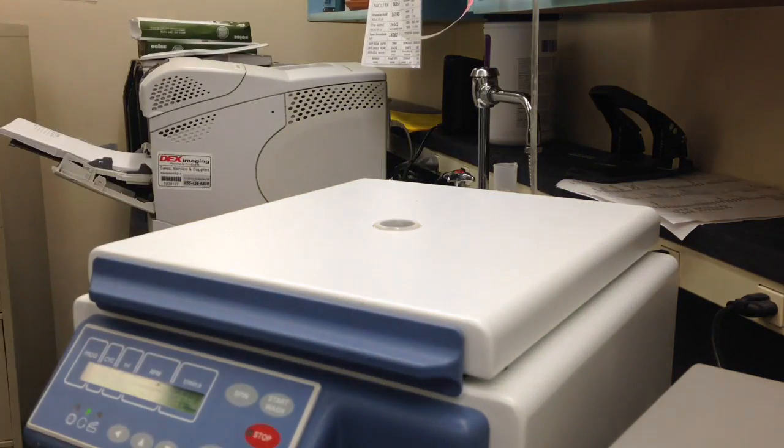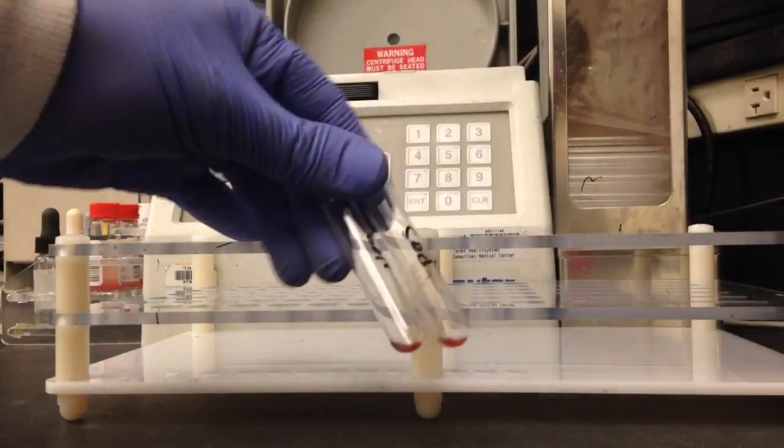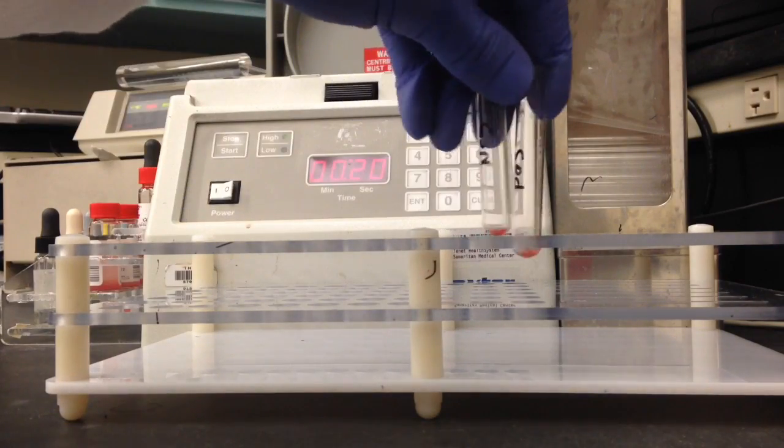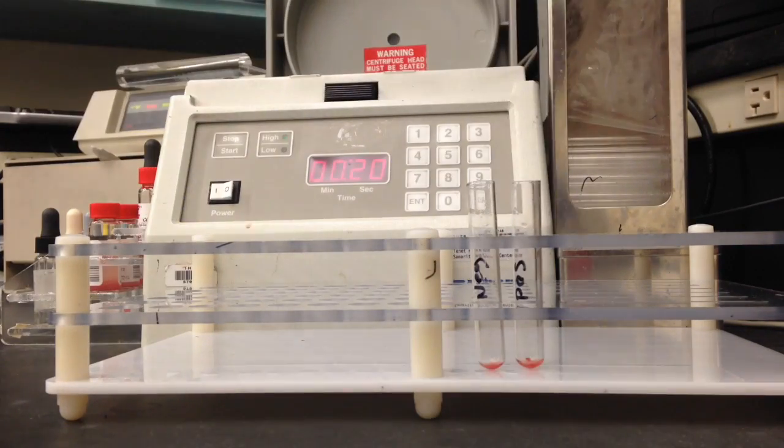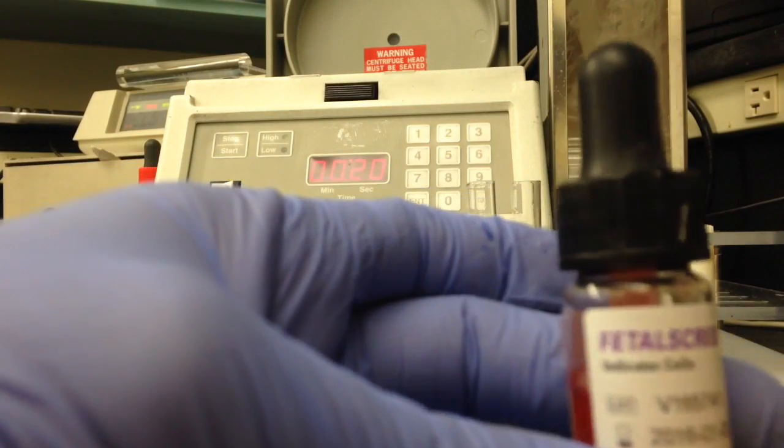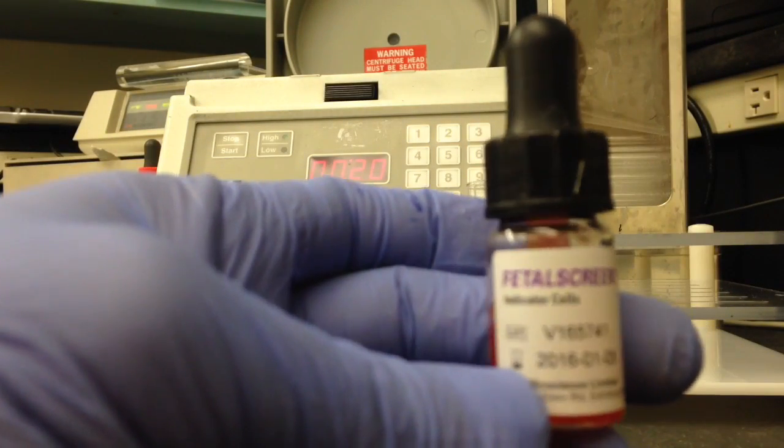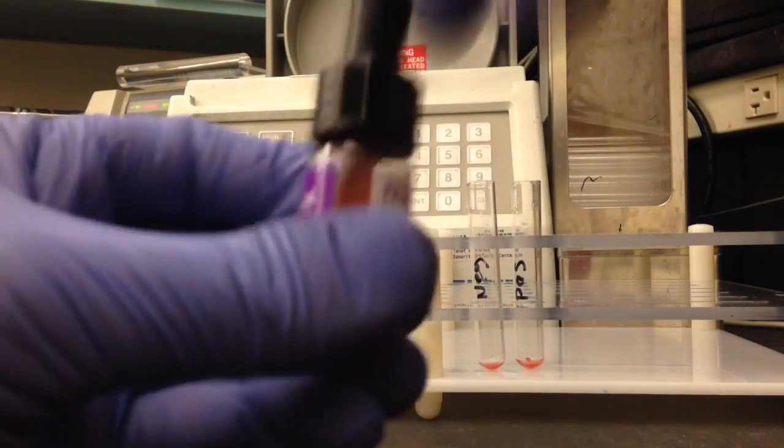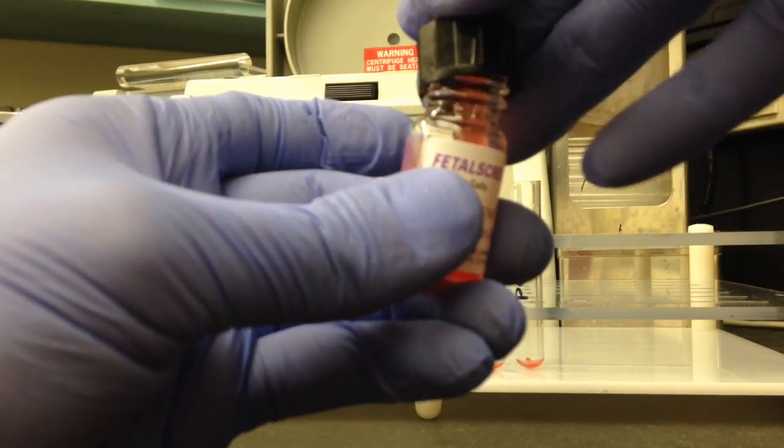So four times and then after that we go ahead and take them out. You can see those are nice and washed and the next step will be grabbing the indicator cells, giving them a quick mix to make sure there's nothing stuck to the bottom, and then we're just gonna go ahead and add one drop of the indicator cells to each of our tubes.